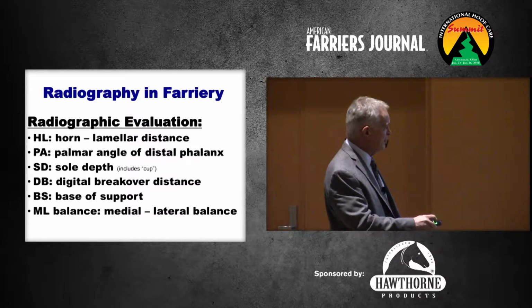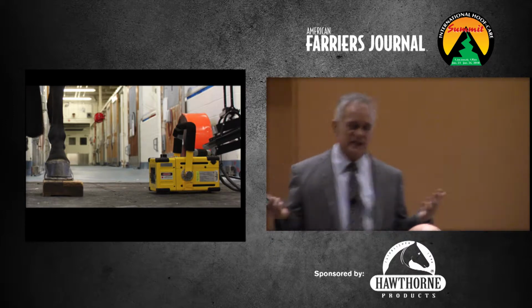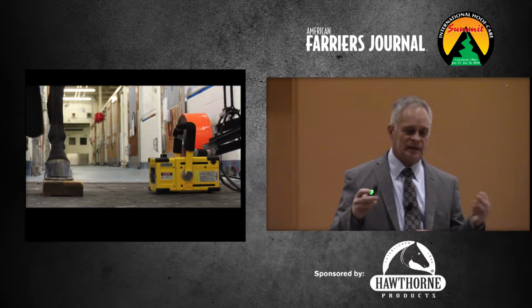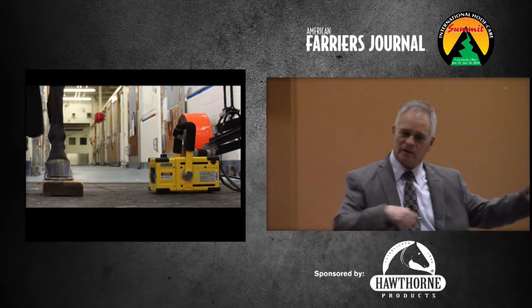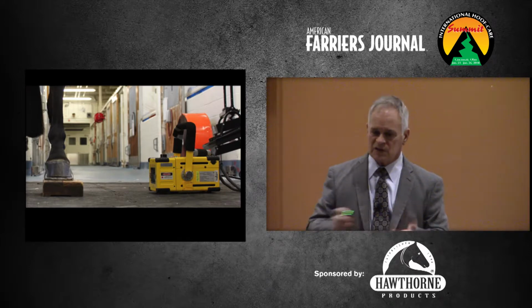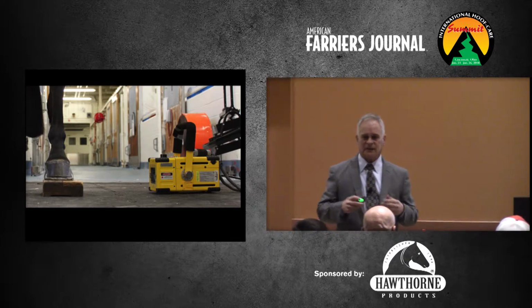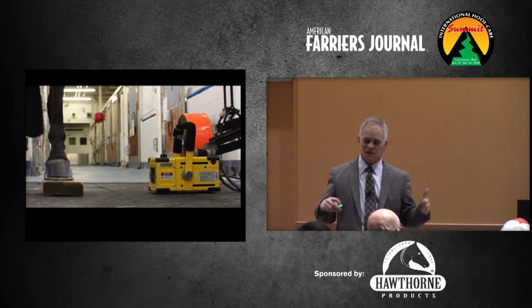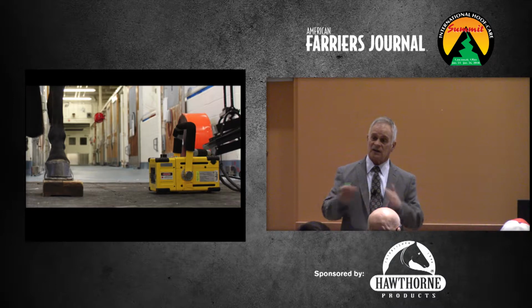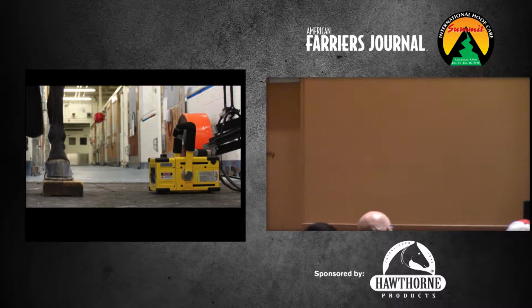Okay, but they're just abbreviations. Right. So with any machine, the question was about technique, and that's obviously more for the veterinarian, but the distance from the machine to the cassette is important as far as causing distortion. So most machines have recommendations, or vets have set up their machine for a certain distance, and it's important that you stay as close to those distances and angles as possible every time, or it's hard to compare one set of films to another. So that's why I say that consistent technique is really important.